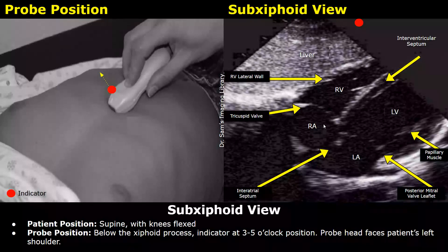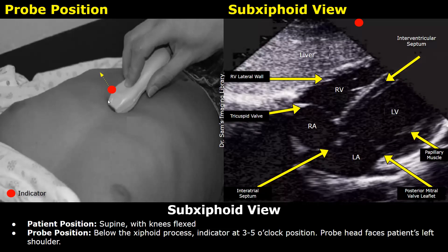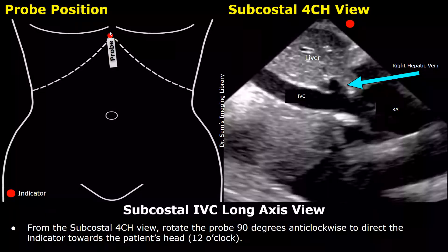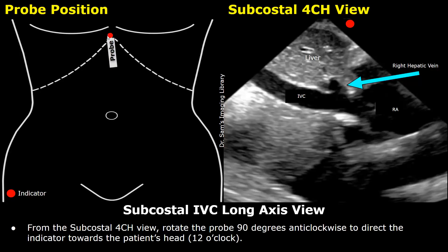The subxiphoid or subcostal view can be taken if there is trouble with the apical four-chamber view. The patient lies in the supine position with knees flexed. The probe is placed below the xiphoid process under the ribs with the indicator in the three to five o'clock position, giving a four-chamber view from a subcostal approach. From this view, rotate the probe 90 degrees anti-clockwise to direct the indicator towards the patient's head at approximately the 12 o'clock position to get the subcostal inferior vena cava long axis view, showing the IVC in longitudinal view draining into the right atrium.